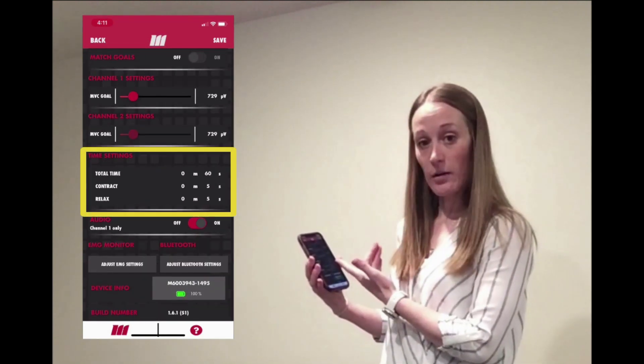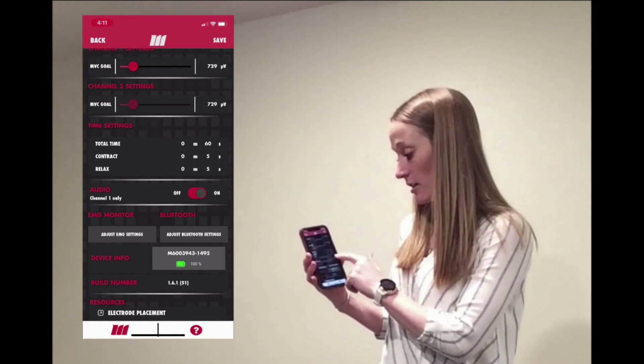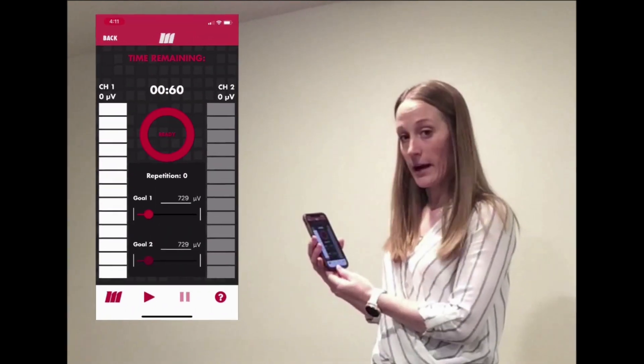I have my time settings right where I want them as well. The most important thing is that the toggle for audio is on. Then I can save it and go back to train.